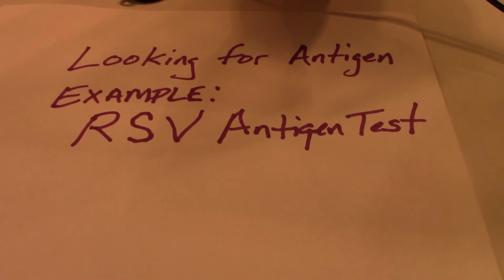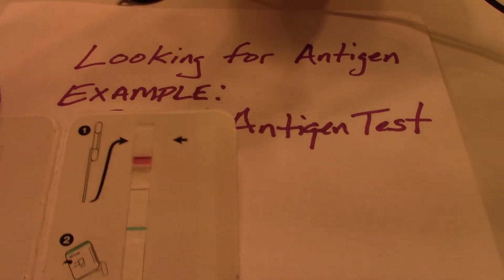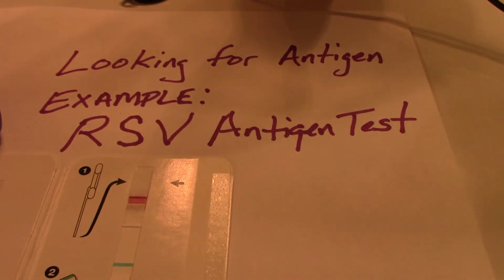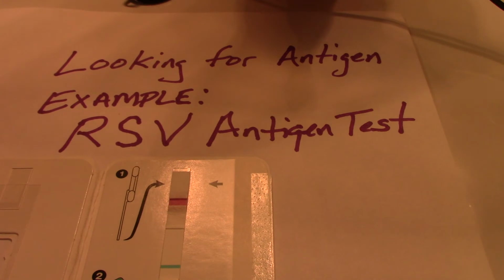So of course it's going to be captured, at least in part, with some kind of antibody. We have a little pad that also has some antibody components mixed in.